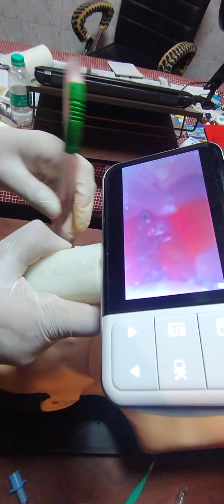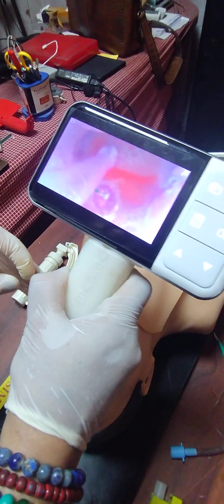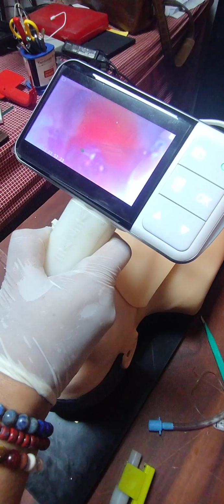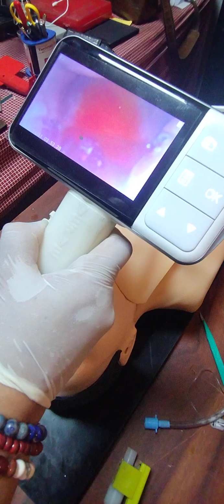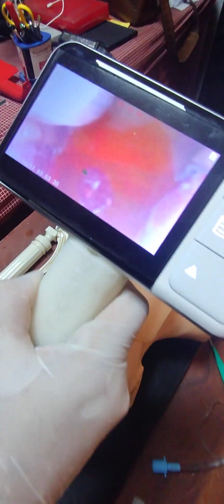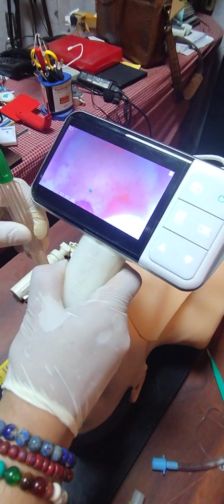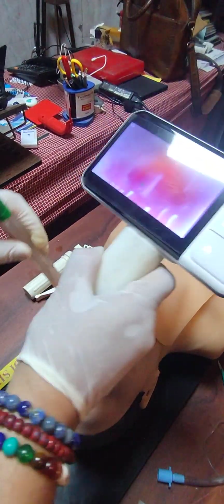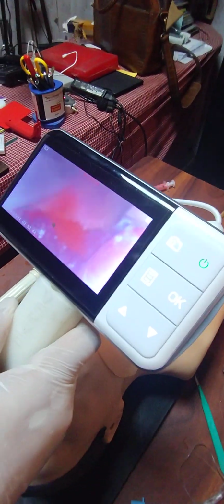You can now, yes, show here, come in front, behind, and pour the fluid. Pour more. Yes. So lot of vomitus. Now cleaning it. Don't pour more. So this is the second scenario.